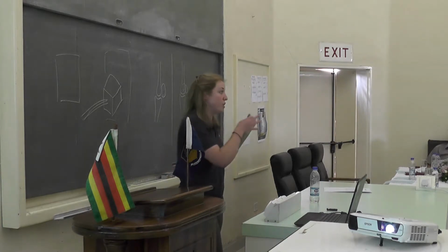Equally, a dorsopalmar or dorsoplantar view will be projected from the dorsal aspect. So in this case, I'd have my generator here, and I will put my cassette here, just behind the leg, and I would have a dorsopalmar or dorsoplantar view.